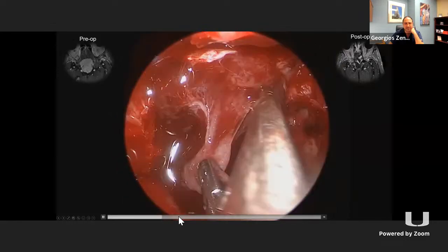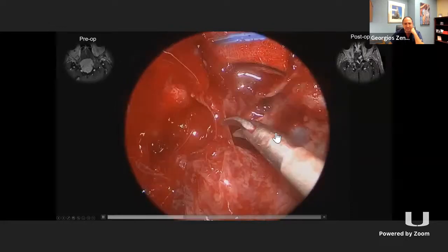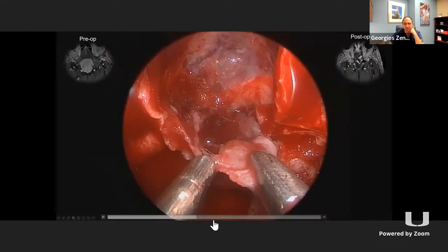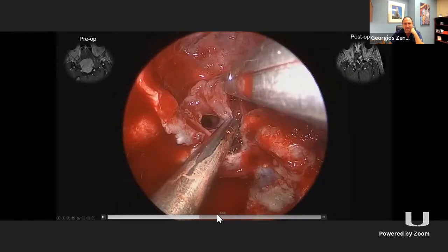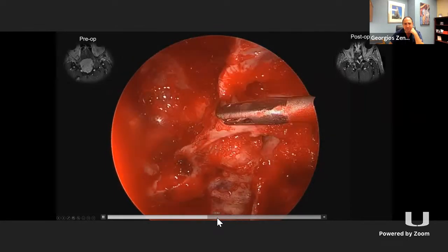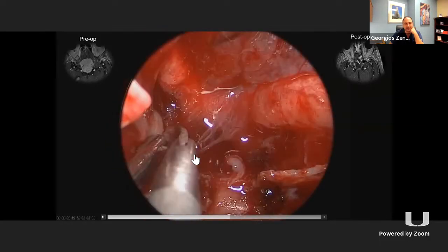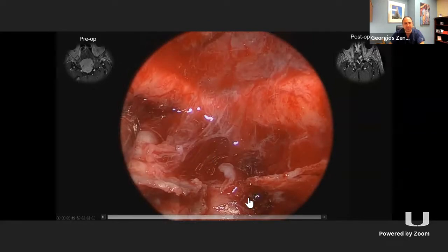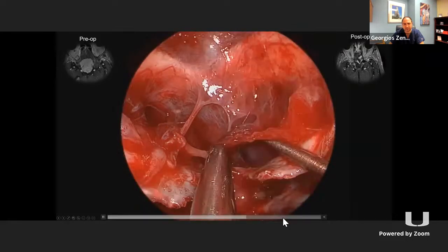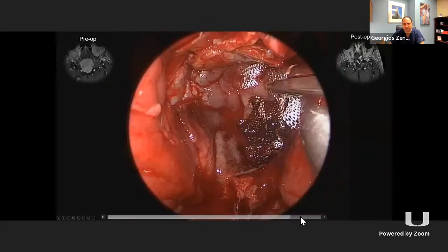Now, this is a tumor that, as opposed to the prior one that we saw, is highly invasive. This is invading the arachnoid, and having this view, I believe, is superior in order to really understand how it's enveloping all the microvasculature, the branches of the superior hypophyseal artery going both to the stalk as well as the optic nerve. And again, following them where they came from allows you to sort of chase them without necessarily crossing them. And then going into that inferior medial optic canal and chasing the tumor there.